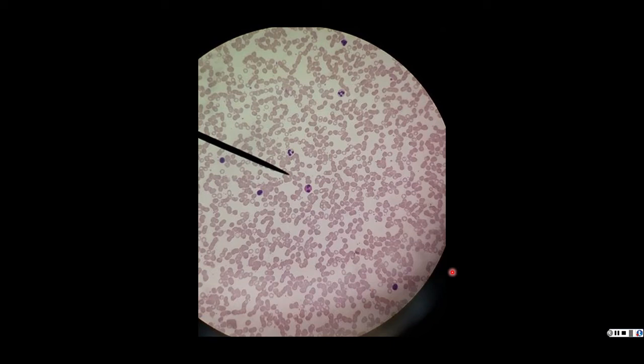So when we first look through, before we zoom in and focus on anything specific, what we will see is something rather like this. And there's a lot going on in this image. We saw this same slide in Bio 137, but we didn't go into nearly as much detail as we do in Bio 139. So right off, there's kind of three things that we see in this image.